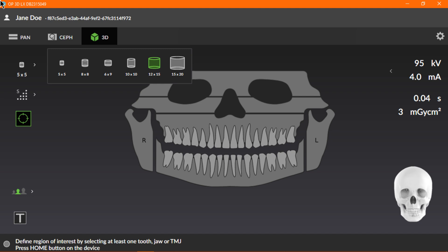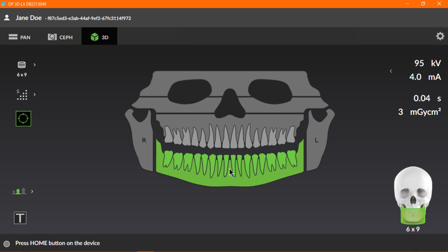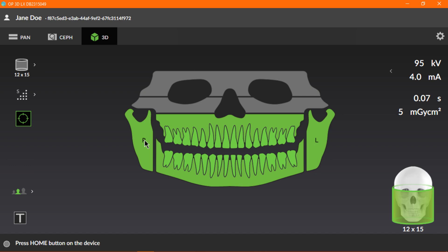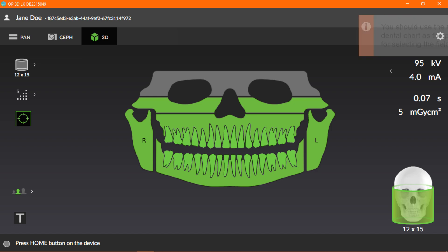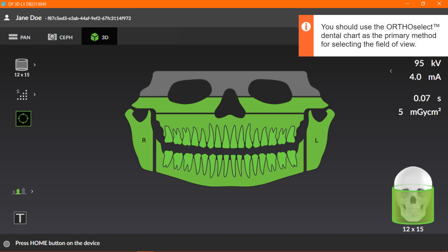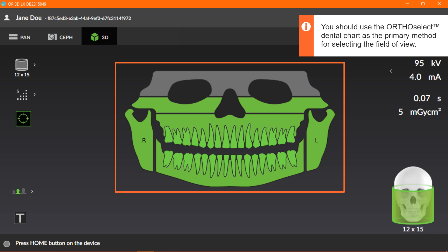For this example, we'll select the lower jaw, upper jaw, left and right TMJ, and the maxillary sinus. The skull on the GUI illustrates an approximate coverage of the selected field of view. It's important to note that you should use the OrthoSelect Dental Chart as the primary method for selecting the field of view.